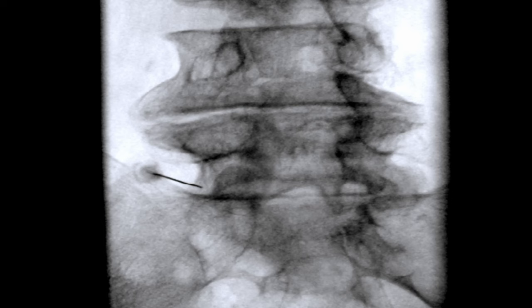I rotated the C-arm more to visualize the contralateral oblique view. In the contralateral oblique view, I turned the C-arm to measure the depth precisely, so as not to violate the disc space. The needle should stay out of the imaginary line of the disc.